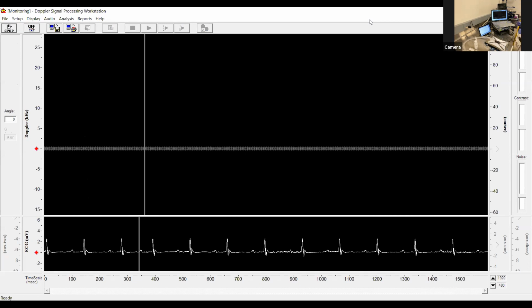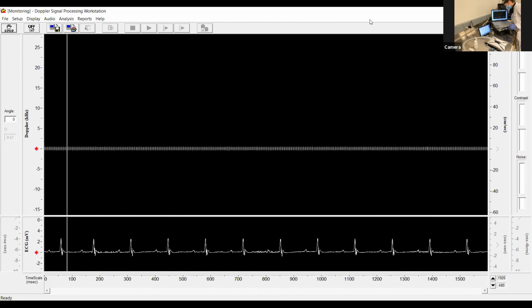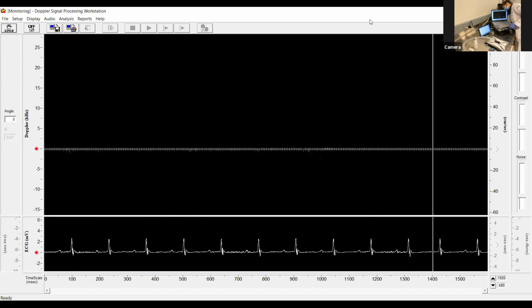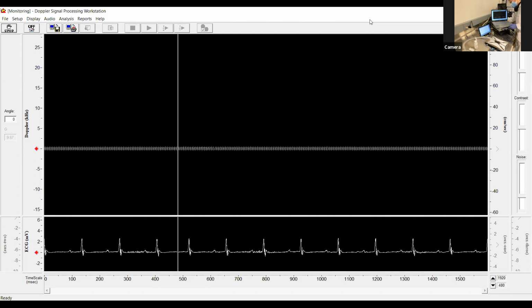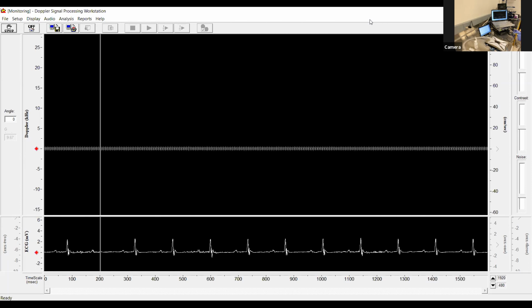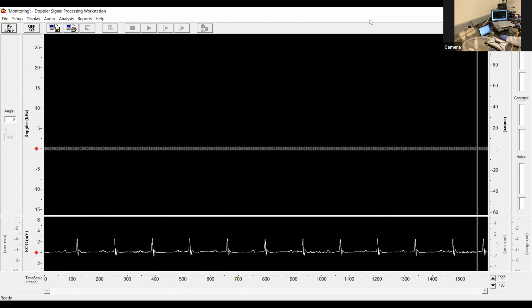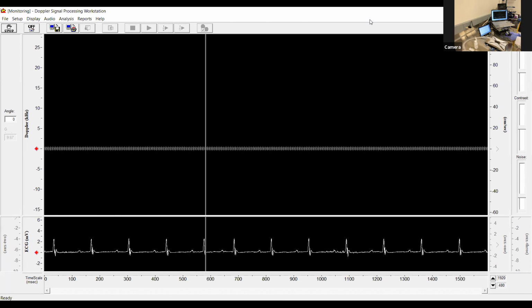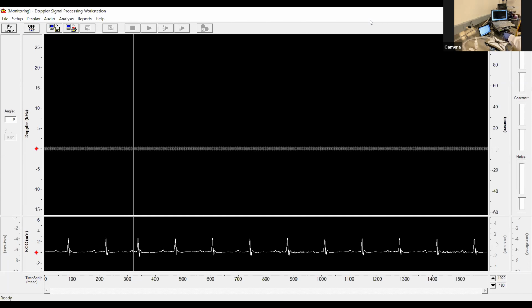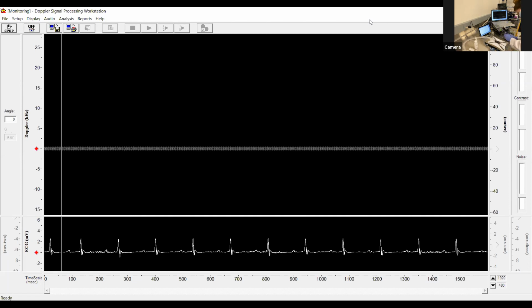The benefit of the Doppler flow system is there are actually two channels on that transceiver. So Sydney can have two probes plugged in simultaneously. What she's setting up now is to receive and display both of those signals at the same time on the computer. One will go in the positive direction, the other one will go in the negative direction. She's also going to connect the micromanipulator because Sydney only has two hands, like most of us. She can't hold both probes stable, rotate it 180 degrees. So this clip, yep, goes like that.